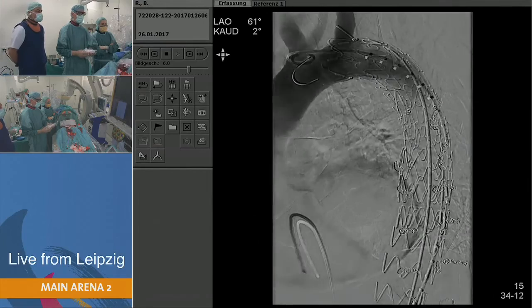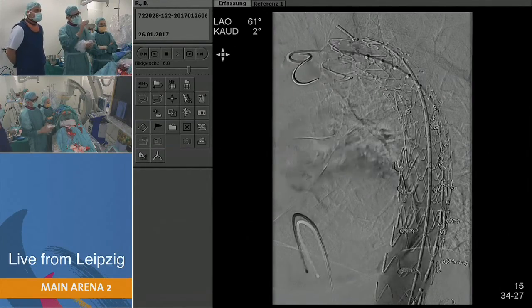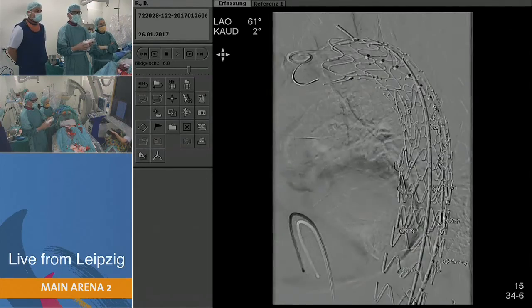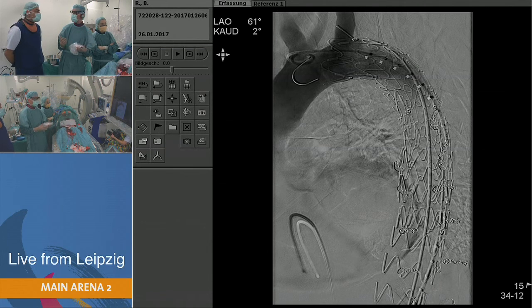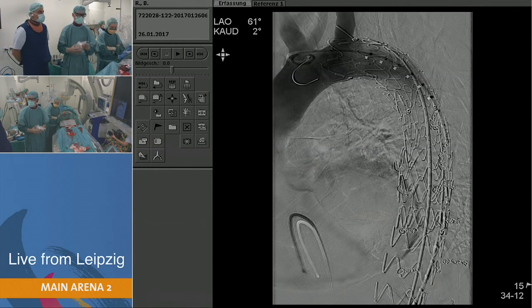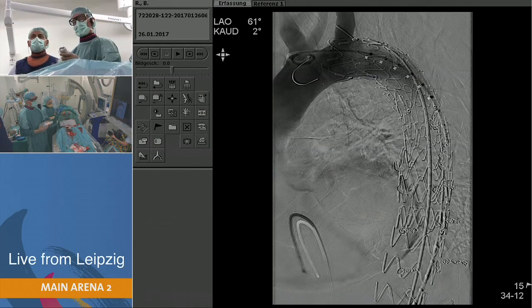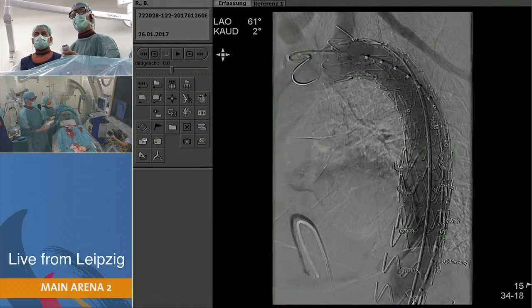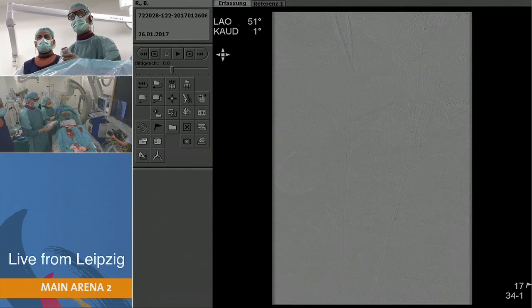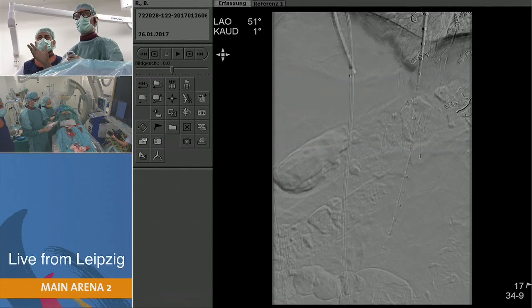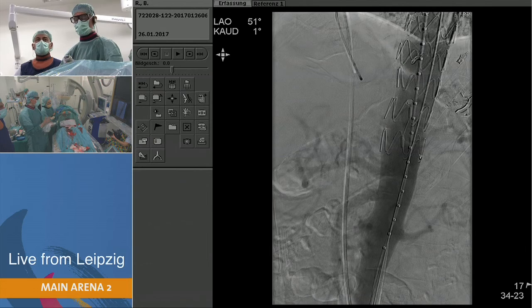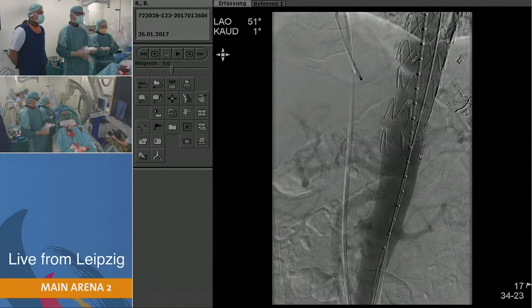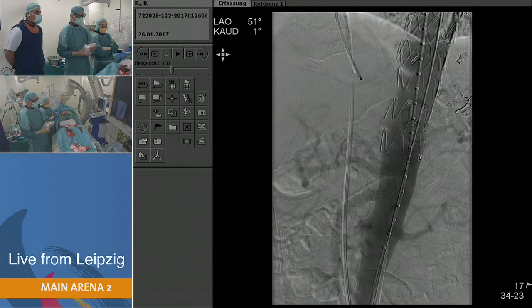This is the angio after full deployment — it looks very nice. As noted, the bare struts projecting into the subclavian artery don't look ideal, but so far we haven't seen any problem. The dissection is no longer visible, and the celiac trunk is open. We also checked with IVUS on the table to rule out any type A dissection, which rarely occurs. The groins are now closed.